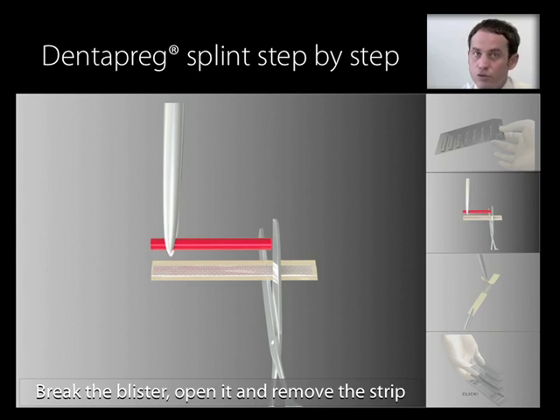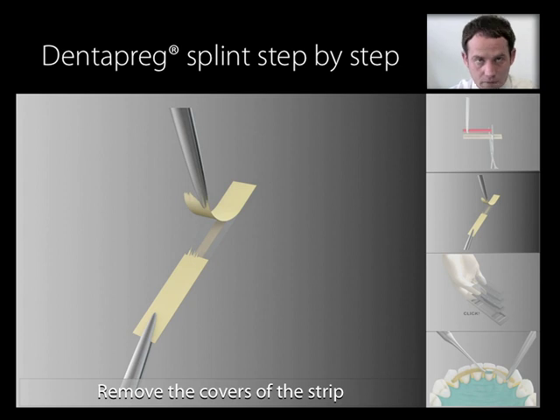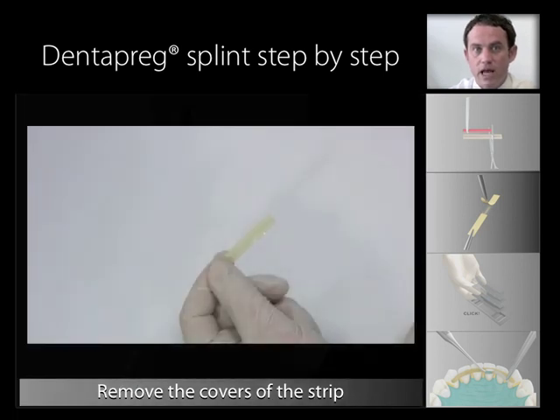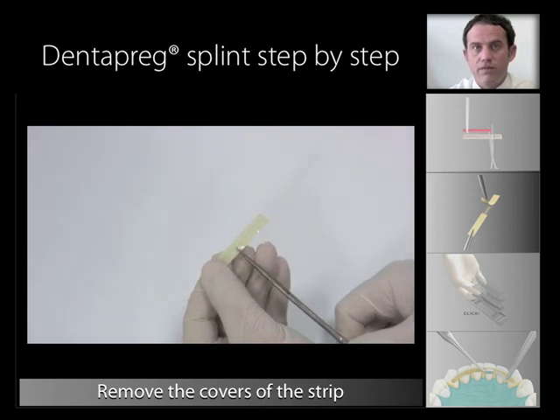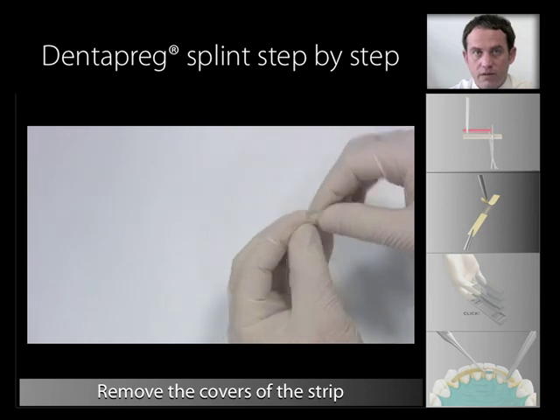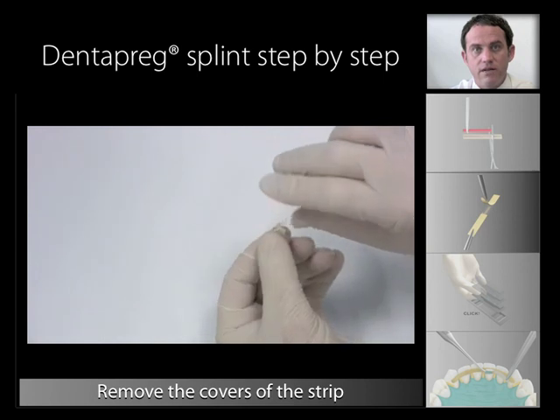Cut the strip with any clinical scissors to the required length. With Dentopreg, no special tools for cutting the strip are required. Remove the protective foil and paper. We recommend not touching the unprotected strip with bare hands; the use of powder-free gloves is recommended. A quick tip: the easiest way to remove the foil and paper is to snip a little somewhere in the middle of the length of the strip, obviously avoiding cutting the fibers. Then peel the paper away from the plastic foil. Removing the remaining protecting paper and foil is then very easy.